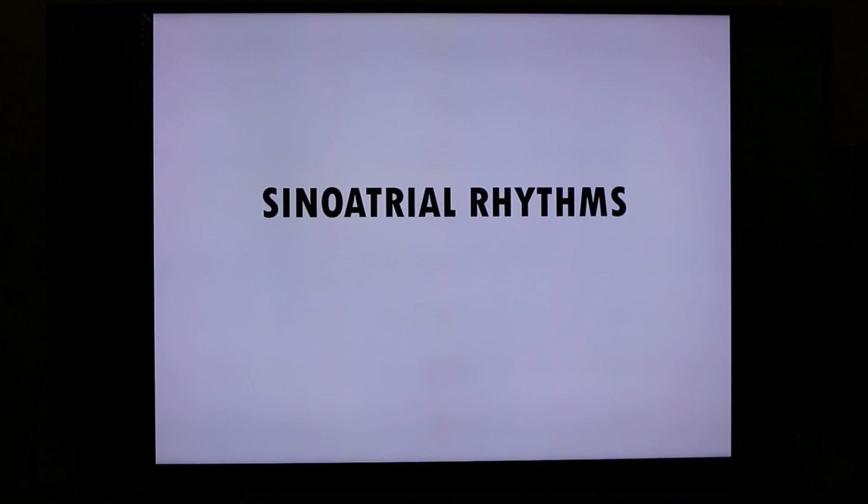Hello, welcome to this basic cardiac telemetry series. Today we'll talk about sinoatrial rhythms.